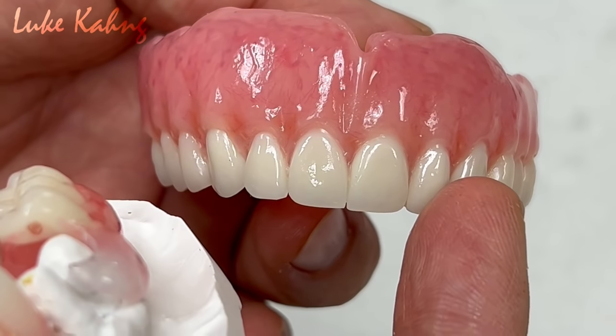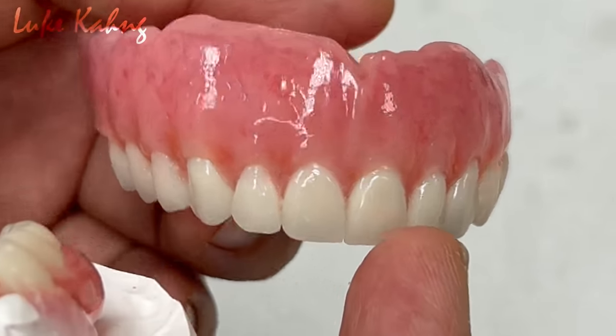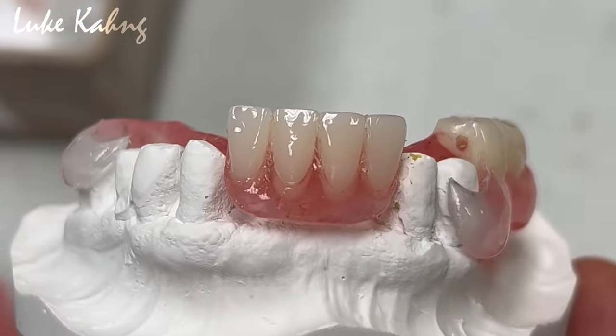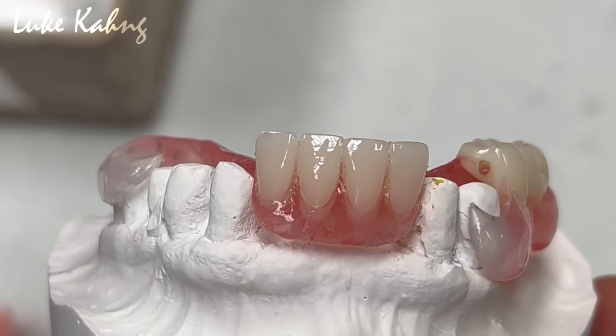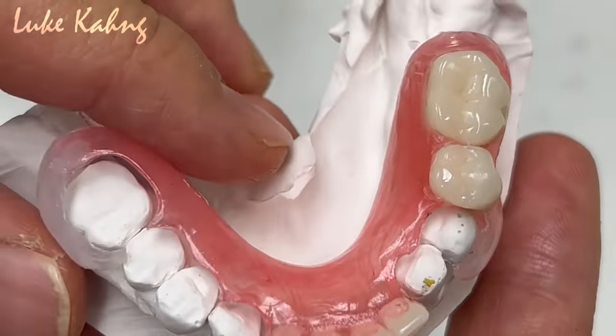We try in the patient's mouth, and then we make the characteristics and the denture setting, and make it a little bit thin, which is the patient's desire. And also it's a lower flex partial, which is totally different materials. This is an injectable material, injection.